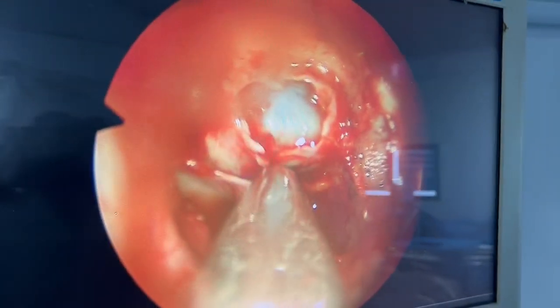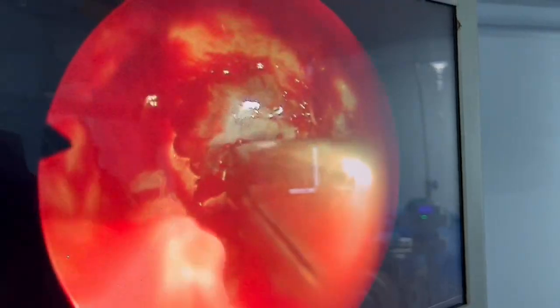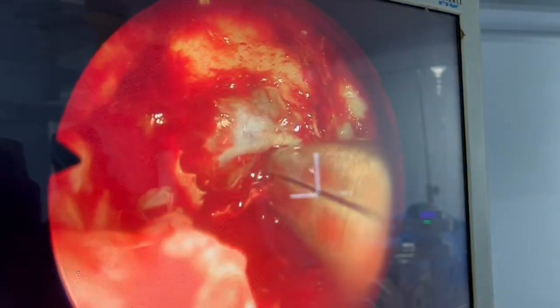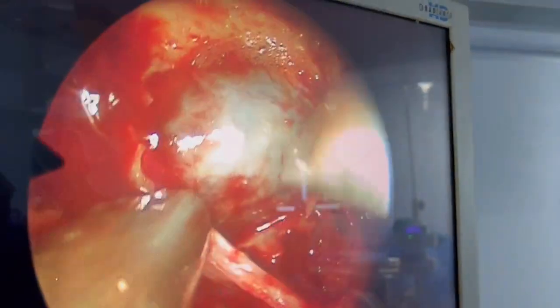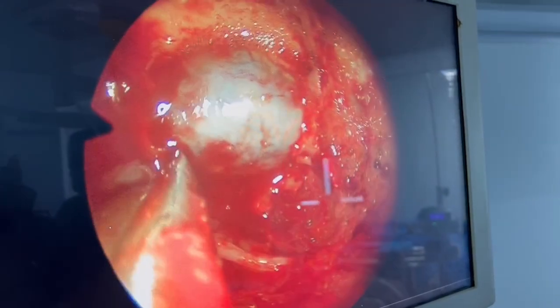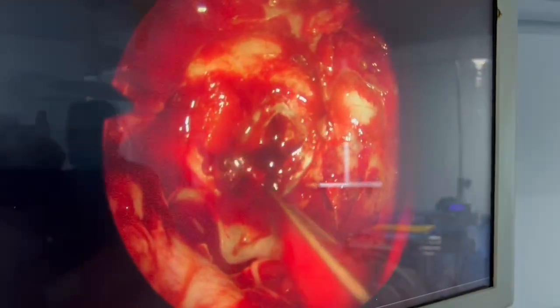There are 4 phases of surgery: nasal phase, sphenoidotomy phase, sellar phase, and reconstruction phase. In the nasal phase, a binostril endoscopic approach was planned and elevation of a right-sided nasoseptal flap, or Hadad flap, was done. In the second step, sphenoidotomy was done, the sphenoid ostium was opened and the cavity exposed, with bilateral posterior ethmoidectomy.